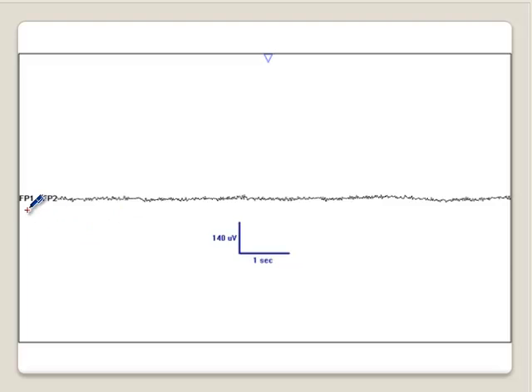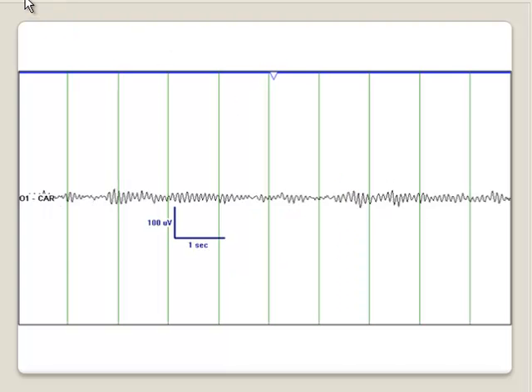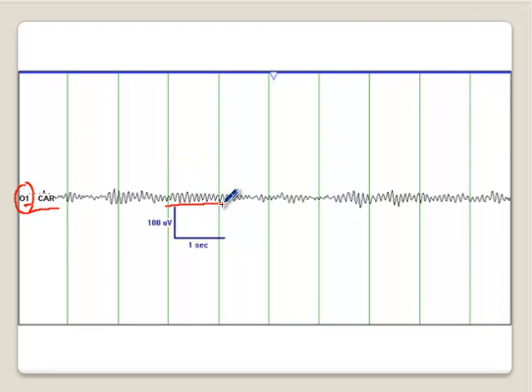Looking at this page, this channel records the potential difference between Fp1 and Fp2, and you see beta frequency — if in this one second you count all these waves, these would be more than 13 waves, so you call it a beta frequency. Here you see a mixture of delta frequency — this is a delta wave, but you have some tiny theta waves resting on top of it, so there are some faster frequencies superimposed on the delta waves. And here you see a very nice alpha rhythm. This is O1, so this is occipital; since it ends with 1, this is from the left side. It's compared to common average reference, and those two dark green lines are 1 second apart, with almost 9 to 10 waves in that 1 second, so you call it an alpha frequency and an alpha rhythm.